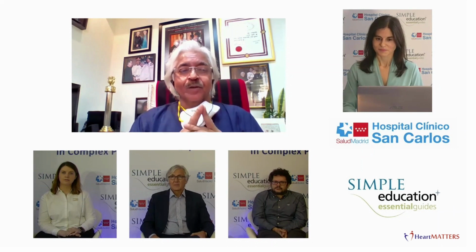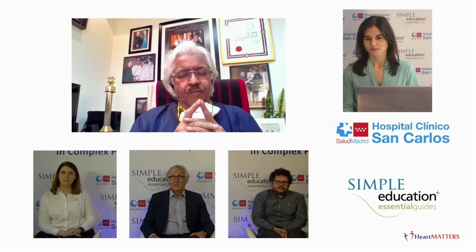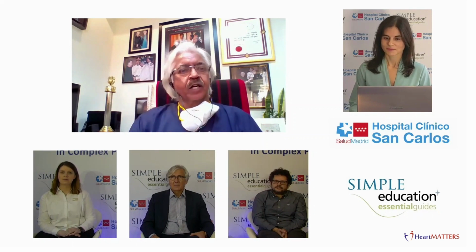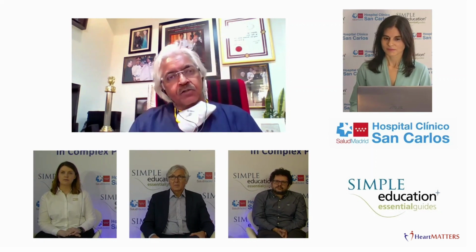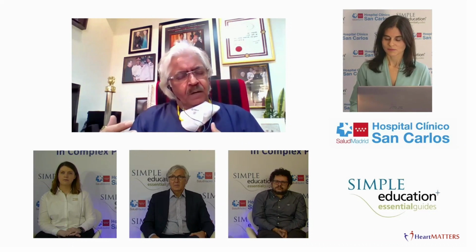I was just going to say one comment. I think this actually tells us my first statement. In a side branch, I'm reluctant to chase physiology because of the complexities of going into a side branch, because of the very situations of crossing, recrossing, distortion, creating problems of the main branch, then going to the side branch, occasional dissection, occasional two-stent strategy.